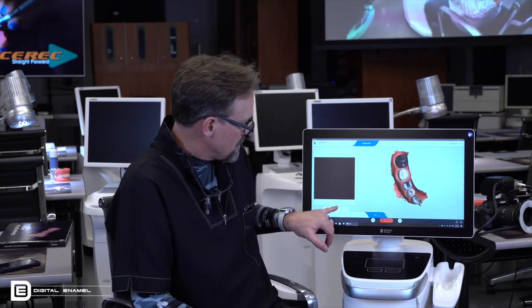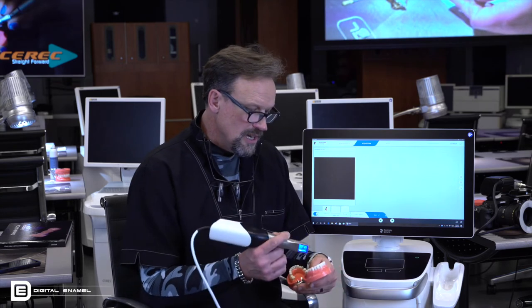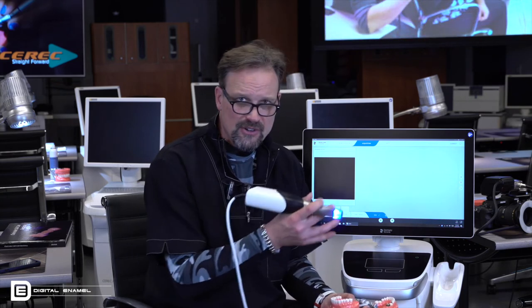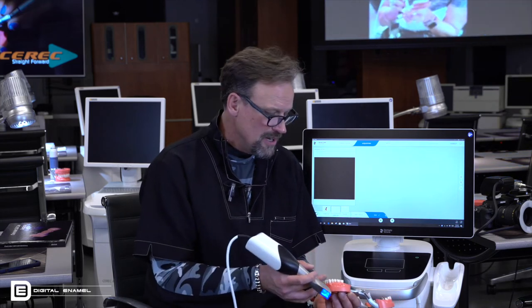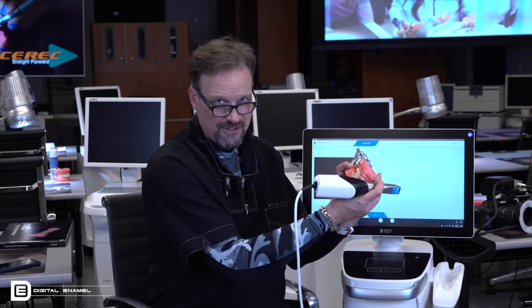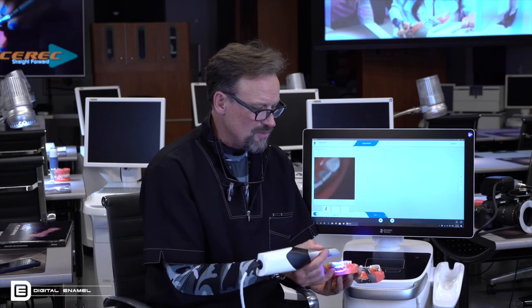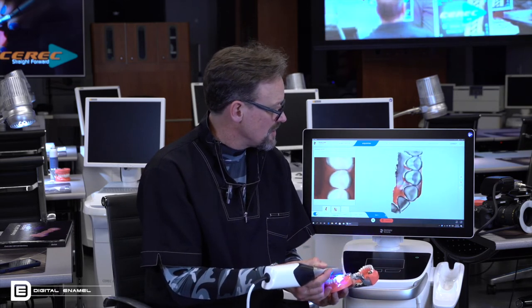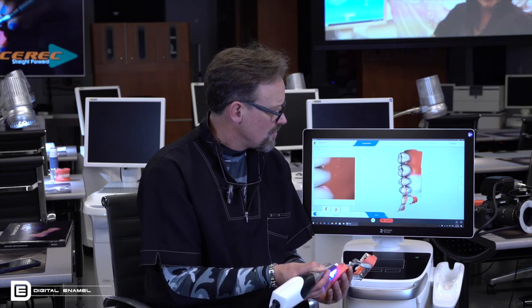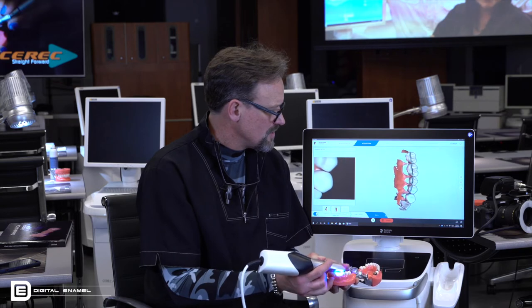All right, so let's go to the upper. Now, with that said, we can go a little bit faster, okay? I'm not really that worried about the accuracy totally. I mean, I am, but I can be a lot quicker because I'm going to mill to the occlusal surface of tooth number 3 and 4. So we'll get it started. I'm still going to do the skeleton. Move around and then go towards the palate.